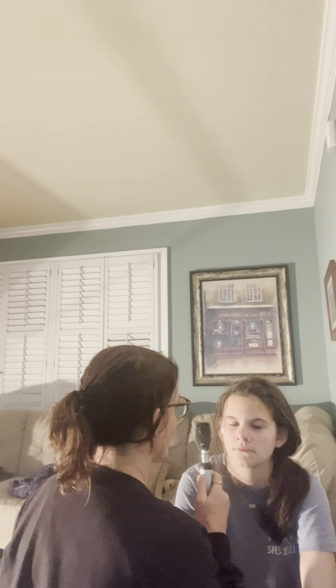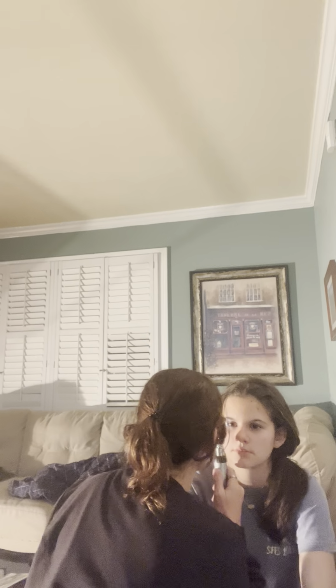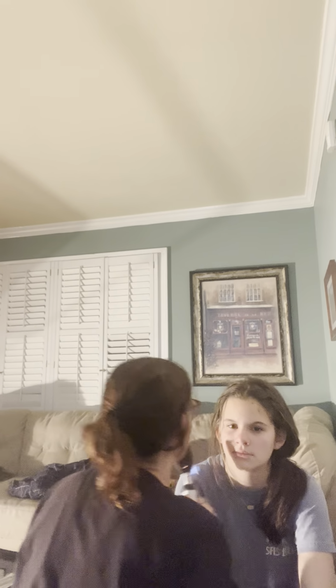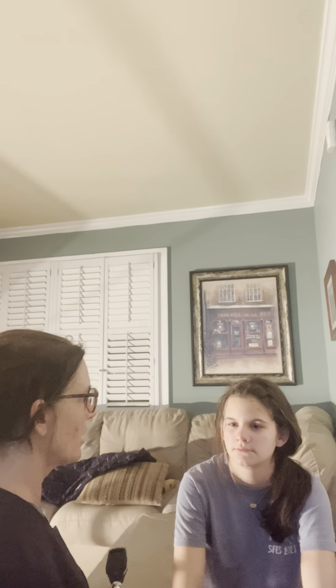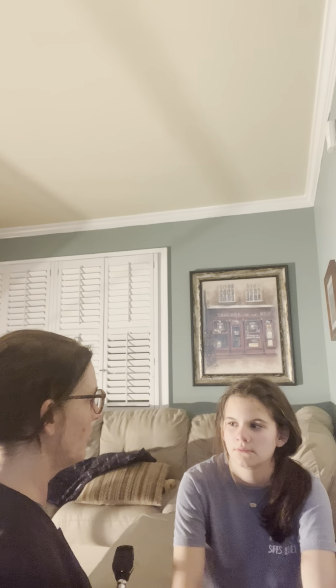All right, Grace, I'm gonna come in, so look straight ahead and you can blink if you need to, okay? I'm gonna get close and personal with you, okay? All right, and I'm able to envision in her red reflex, I'm able to see her blood vessels, and able to see the optic nerve, and they are all intact, and there are no abnormalities, there's no swelling of the blood vessels. I could see the optic disc and the macula and envision them all equally.